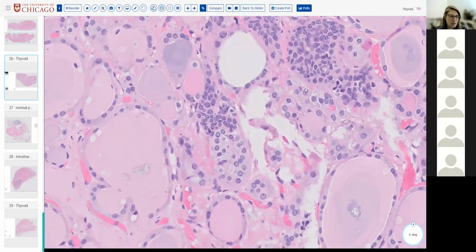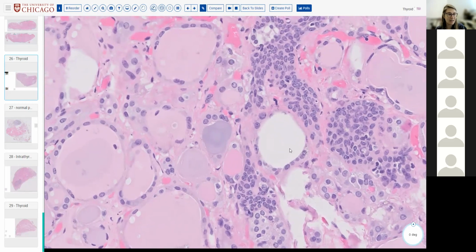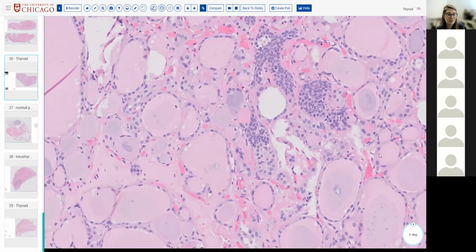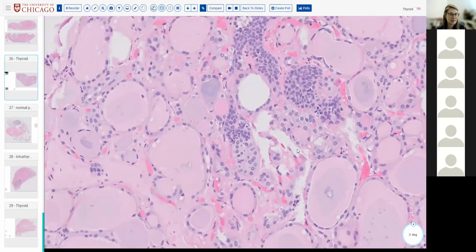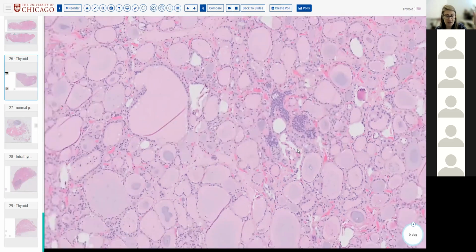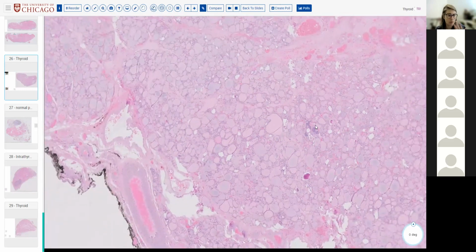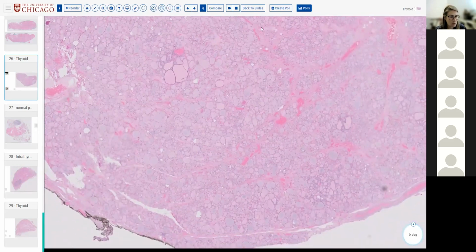Yeah, so these are C cells, and sometimes you see them with the ultimobranchial body. In this case, we got lucky and we did. This is probably not a case of C-cell hyperplasia because you can expect to see them in the context of the ultimobranchial bodies, but we may want to throw a calcitonin stain on there and see if they're positive. All right, so that's totally a normal structure in the thyroid. I don't even mention it because it's so normal.